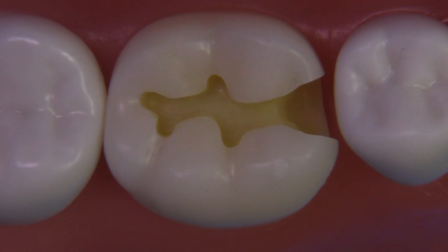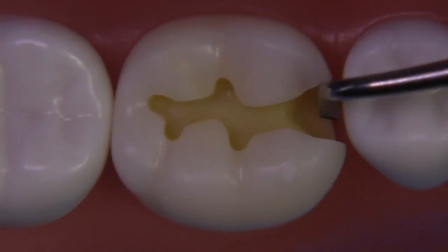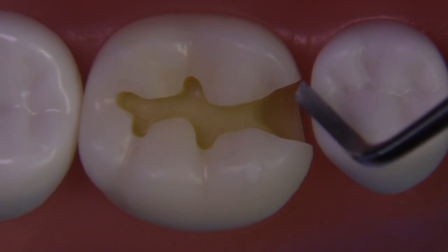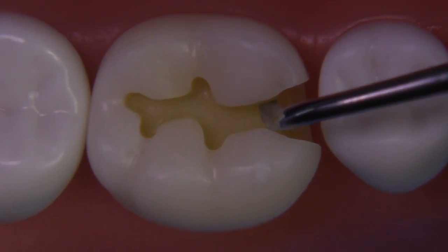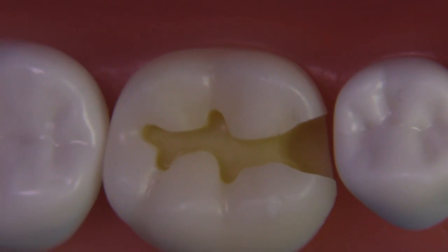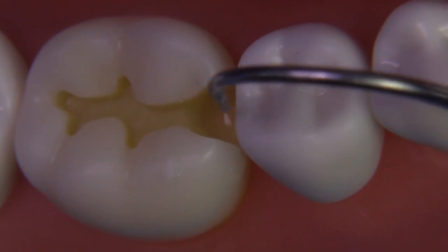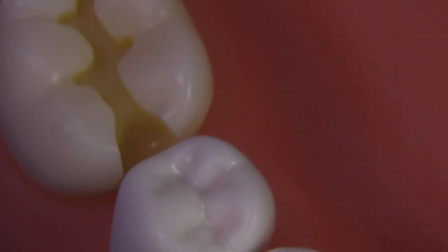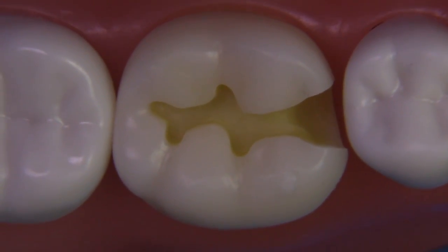Here's the final preparation — I think it meets the standards. One thing I like to do is use the gingival margin trimmer to smooth off any loose enamel rods. You could even put a bevel down at the gingival and leave the axial area alone. They expect to see something hollowed out like this; this is typical for an examination — you're not going to have the ideal box shape because of the caries. Make sure you're at least 1.5 millimeters deep, 1.5 to 2, and that you've met all the requirements of the examination you're taking. It's really a good idea to go back over with an explorer and make absolutely certain that you have no soft areas. The Academo caries tooth has soft decay and the examiners will feel for this.